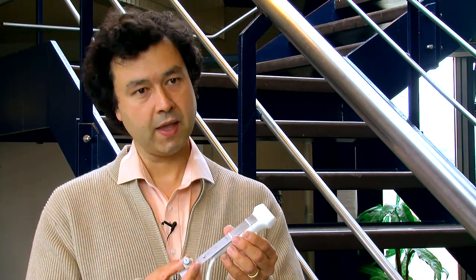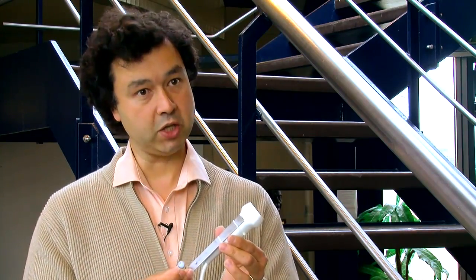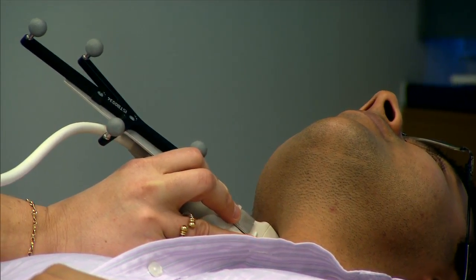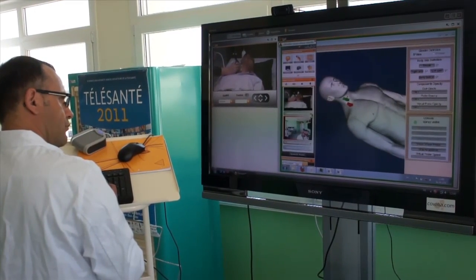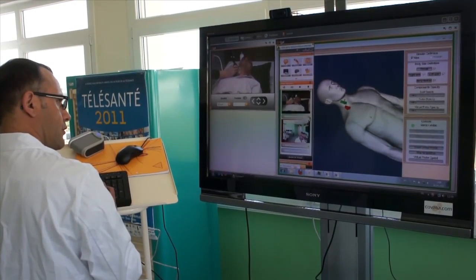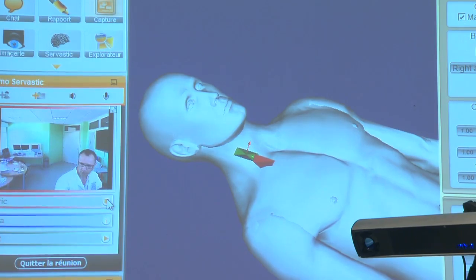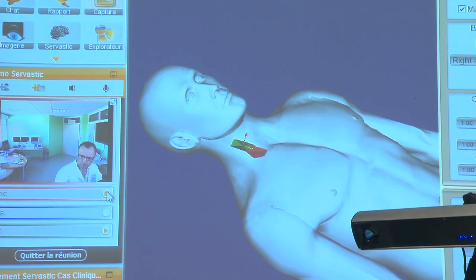The tracking system allows us to position this object in 3D with respect to the patient. This 3D position, captured by the tracking system, is then reported on the remote side on a 3D model of the patient, allowing the remote expert to really visualize the position of the probe.